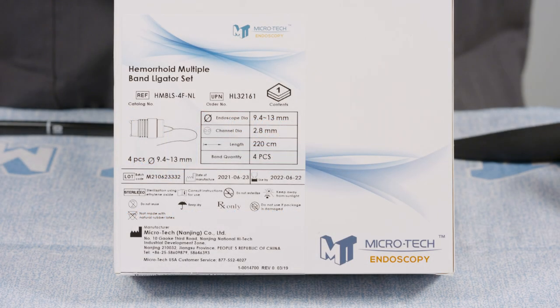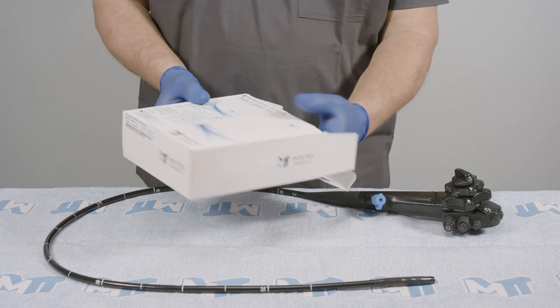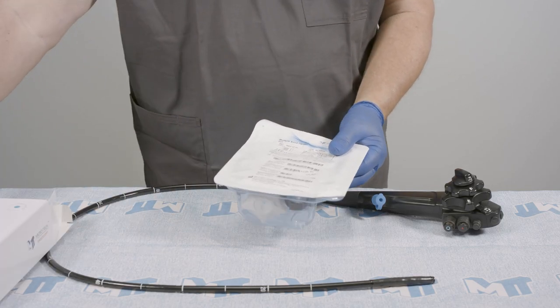The Microtec Multi-Band Ligator Set comes packaged sterile, one per box. The labeling includes the order number, date of manufacture, and use by date. Within the box is the plastic tray with Tyvek lid.